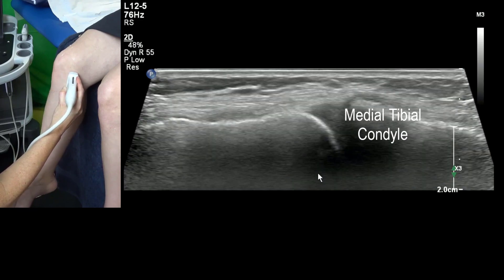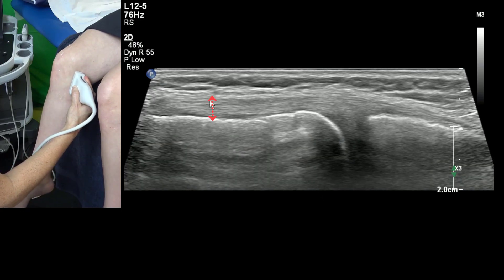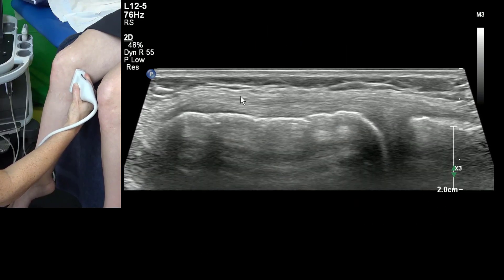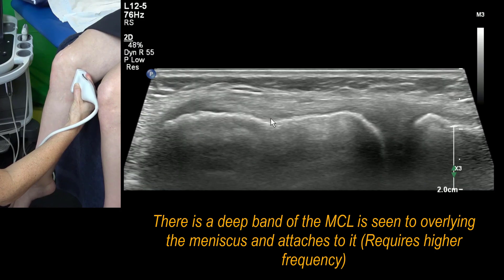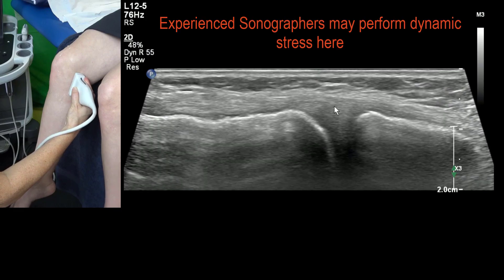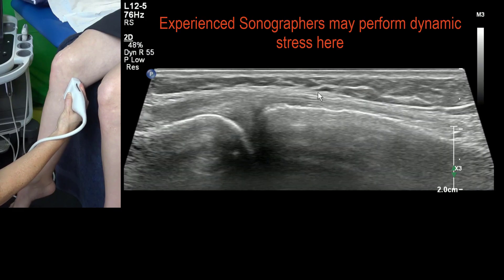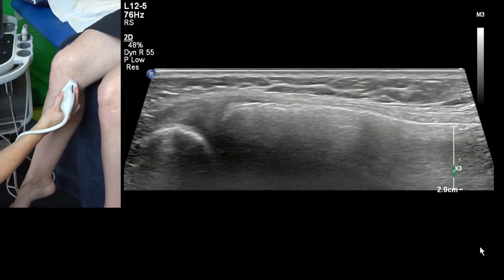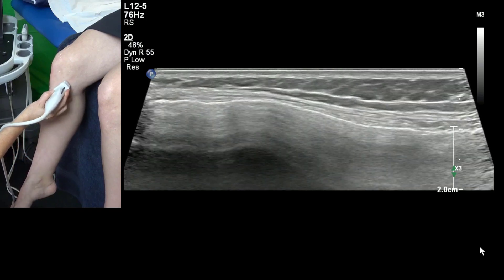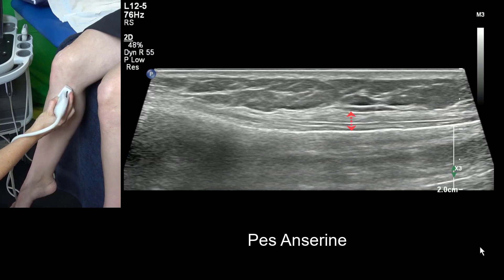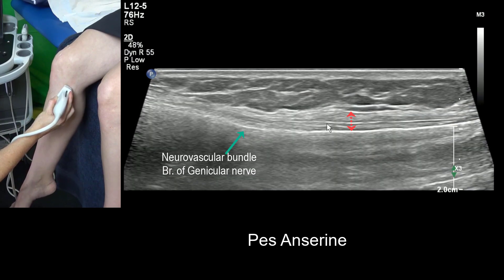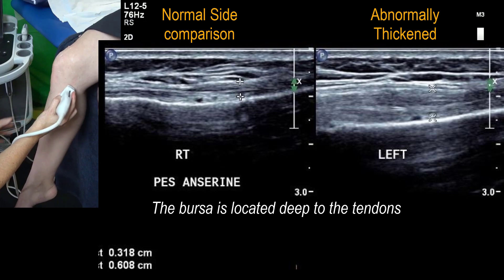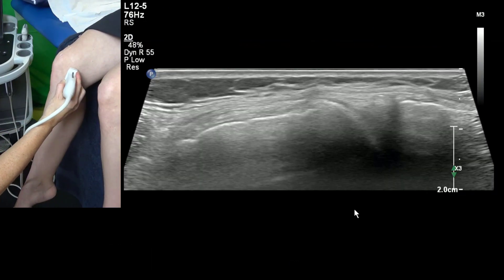Moving to the medial knee, the first structure we land on is the medial collateral ligament. The MCL is much easier to see when the knee is bent. The proximal end is where we normally take measurements and compare with the other side — that's where strain injuries occur. There's the medial meniscus, which should be flush with the joint, and here's the distal MCL. From this position we rotate anteriorly and oblique slightly to find the pes anserine tendon, looking for pes anserine bursitis and assessing for clinical tenderness.